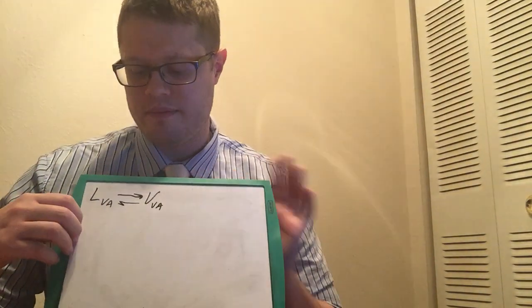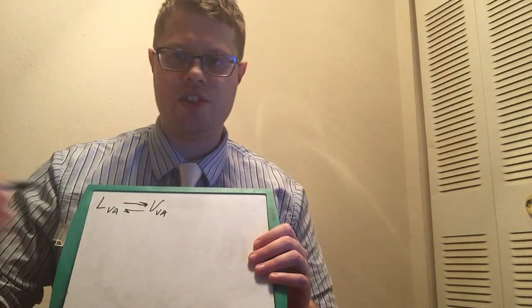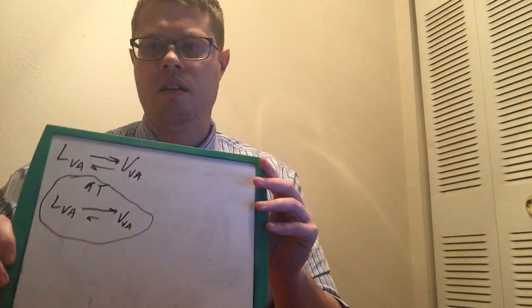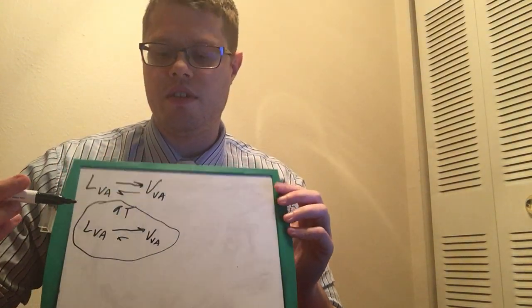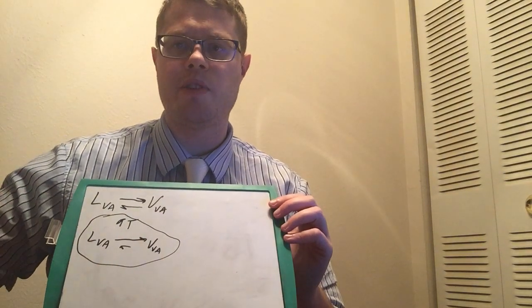If we increase the temperature, then we shift the reaction in the other direction, getting much more vapor.